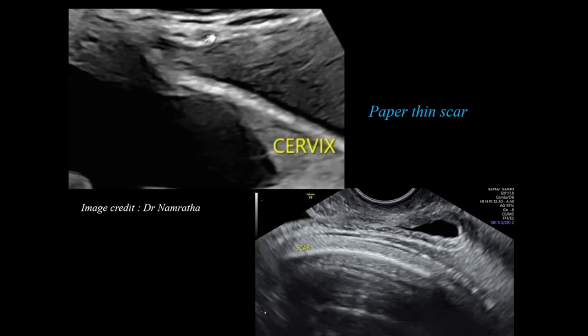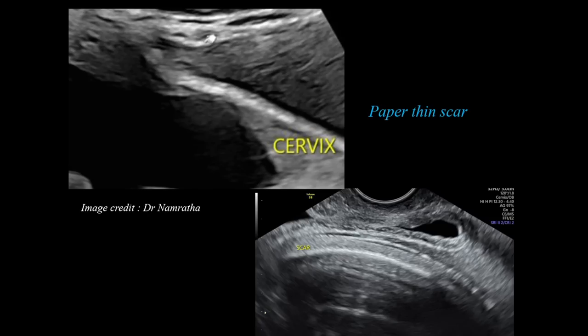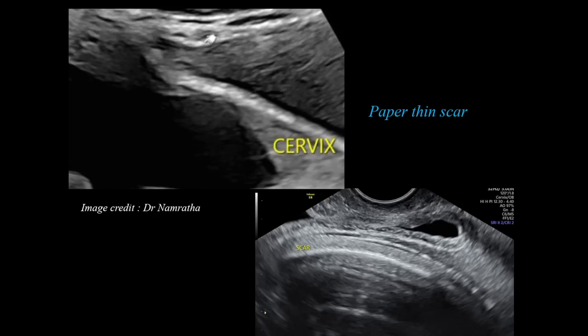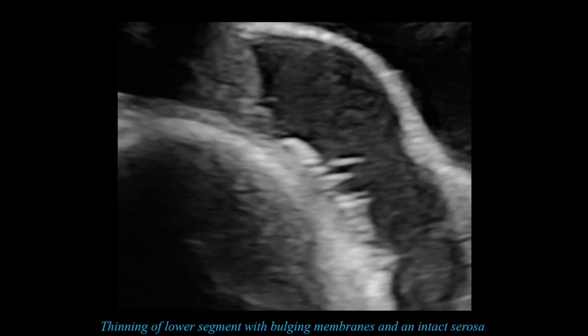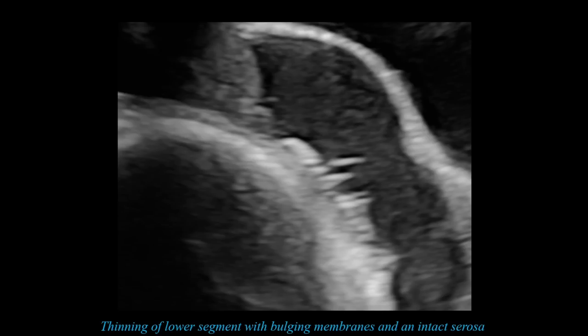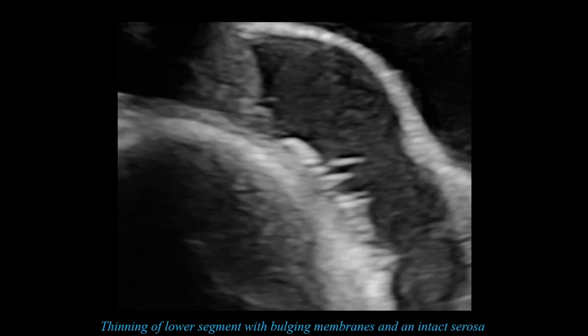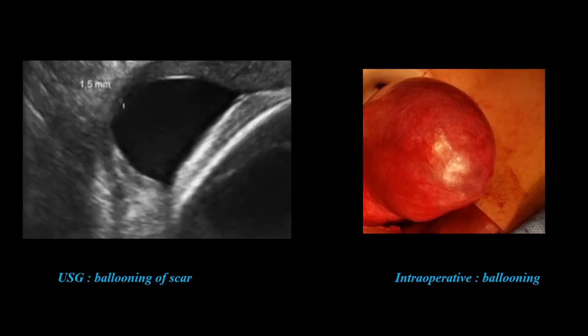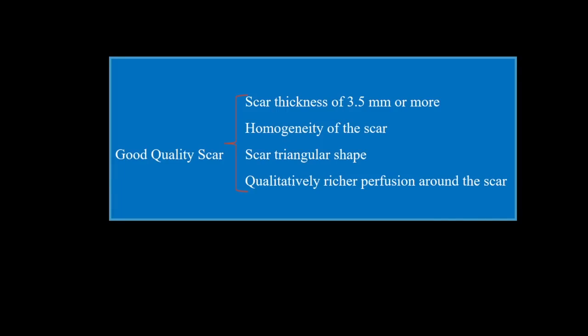These example images include one showing a paper-thin scar with significant myometrial thinning, though the bladder mucosa adds relative thickness. Transvaginal ultrasound images also demonstrate significant myometrial thinning. Another case shows such severe thinning that uterine dehiscence is present — ballooning of the membranes is visible with the fetal head seen underneath. A corresponding intraoperative image confirms the ballooning, consistent with uterine dehiscence.